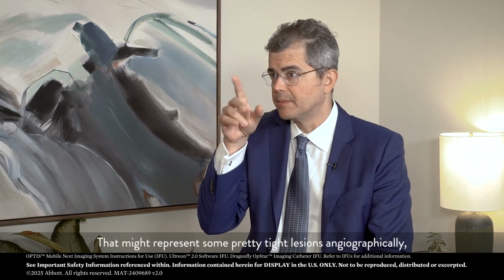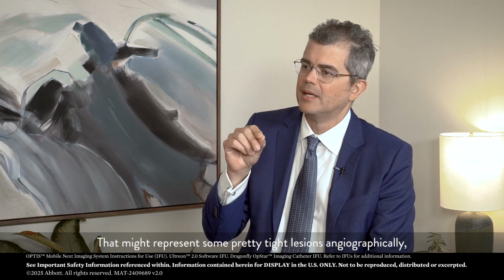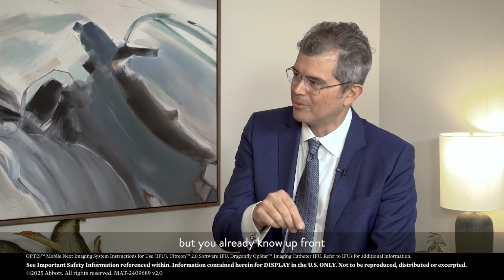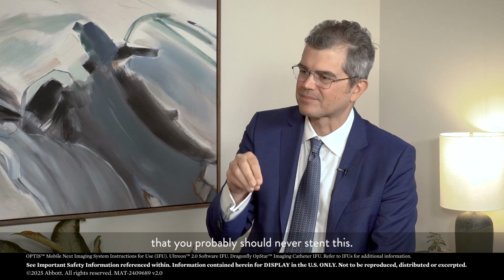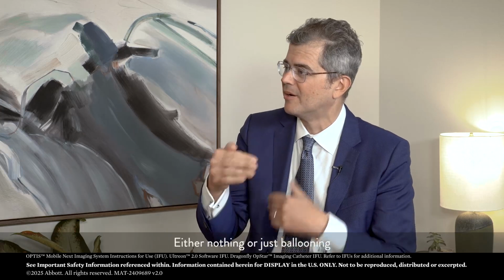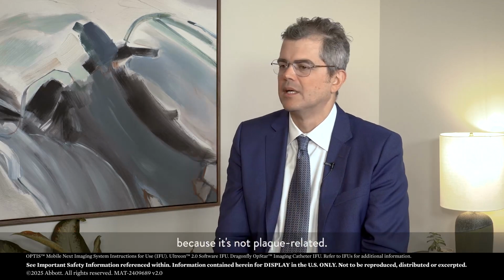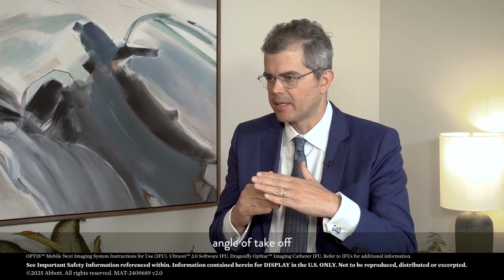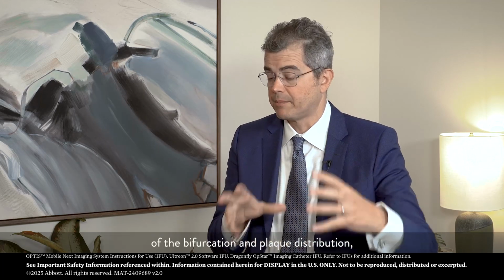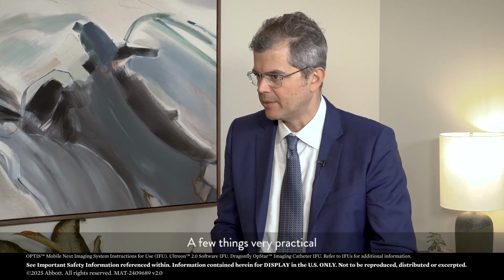That might represent a pretty tight lesion angiographically, but you already know up front that you probably should never stent this, either nothing or just ballooning to even out that carina, because it's not plaque related. So having this first look at the angle of takeoff of the bifurcation and plaque distribution will put you in a very strong position in anticipating what is next.